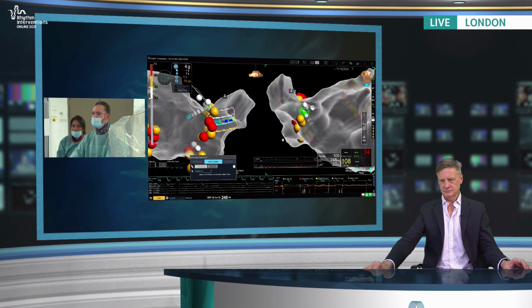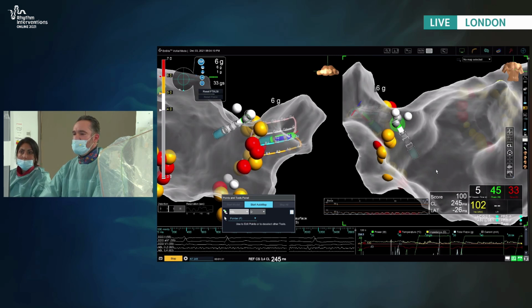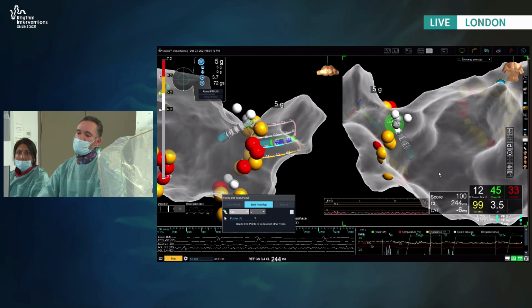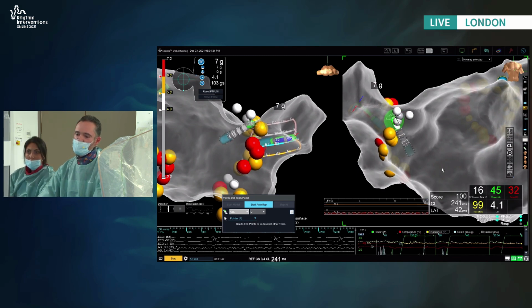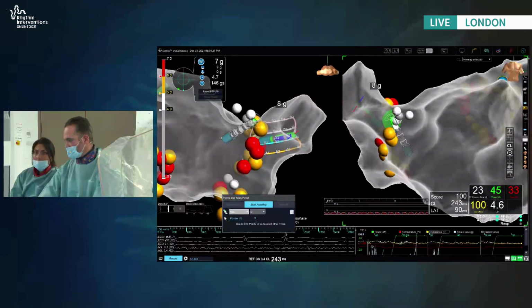I'm just finishing the line, like we discussed whether we should or shouldn't, but I think we're just about done with that anyway. I've cheated and looked at the ECG, and I thought a little bit suspicious of flutter, so I was mulling over the idea of pulling across and seeing how it looked on the CTI, see if it's ahead of the CS proximal, maybe entrain from there perhaps.